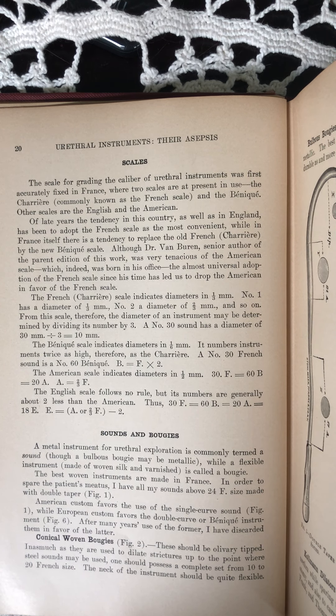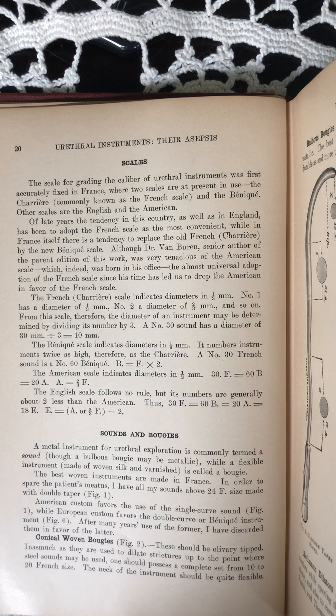American custom favors the use of the single curve sound, while European custom favors the double curve or banique instrument. After many years use of the former, I have discarded them in favor of the latter.